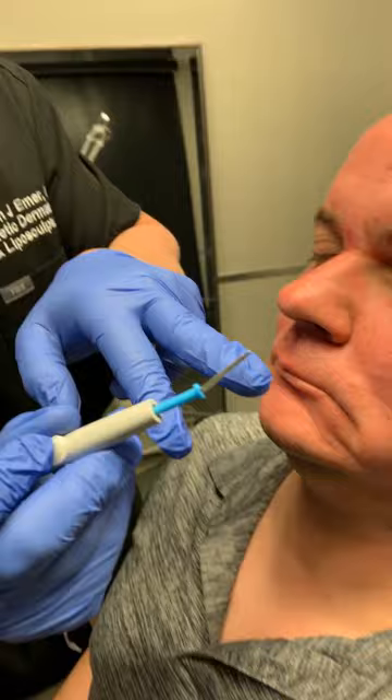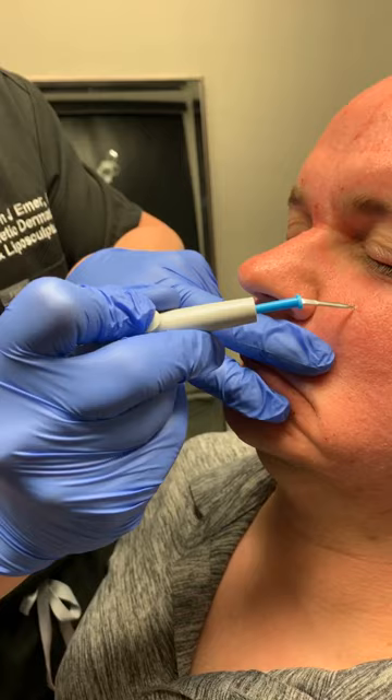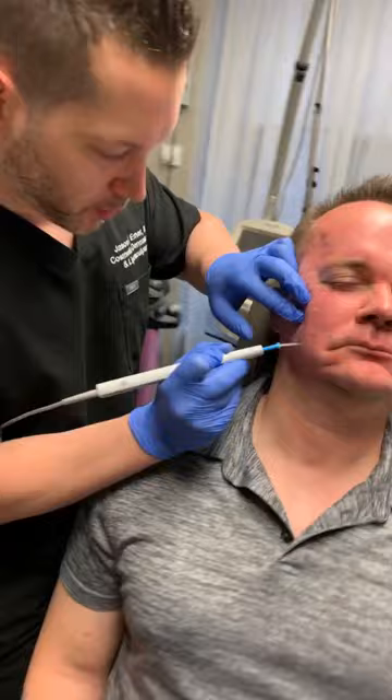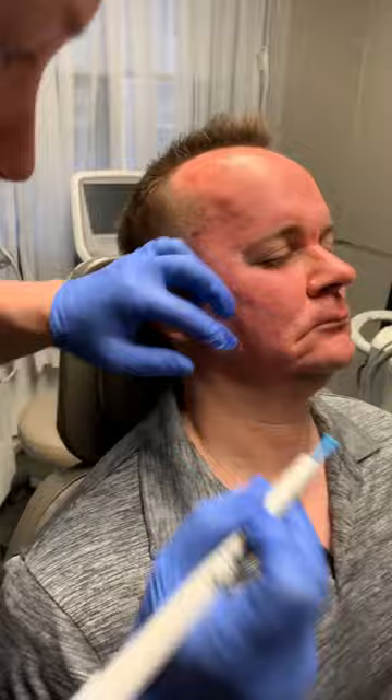Take a look — we've removed that keratosis. You get the base of that keratosis and shave it off. He needs these to be removed because they're not pretty. They'll grow if he ages. We're just getting lightly the ones that I know will sort of peel off in the next few weeks. You can just peel them off once you burn the base of them.